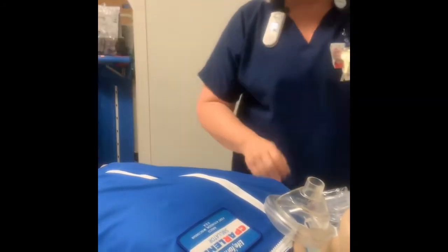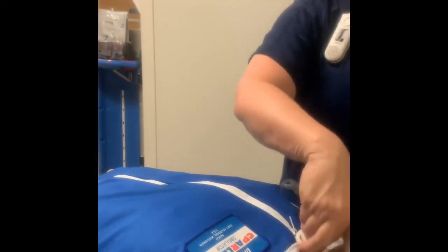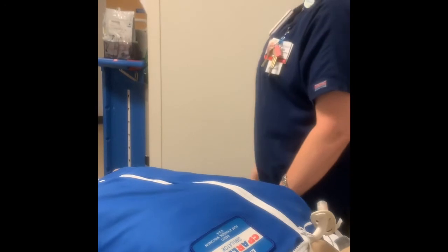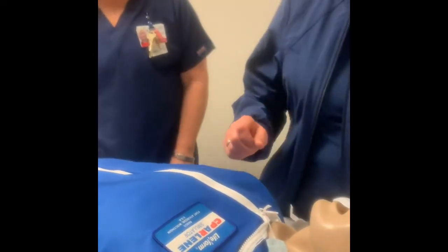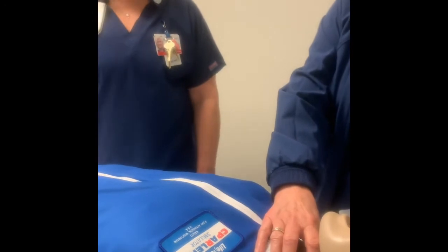I have another patient who has a tracheostomy, and the upper airway is intact, the larynx is intact. So my patient has just a tracheostomy, larynx is intact, and it falls out. I need you to take care of this patient for me. Okay, I'm going to call SWAT. I'm going to airway here, but I'm going to cover this. Okay, what are you going to cover it with?